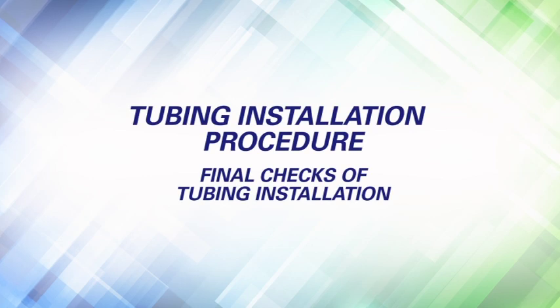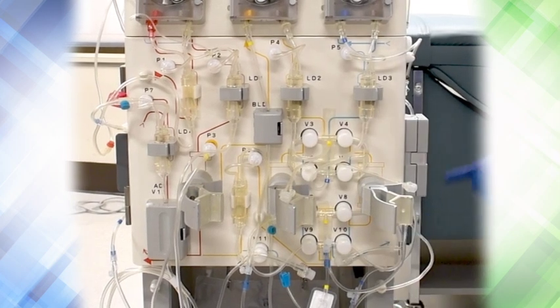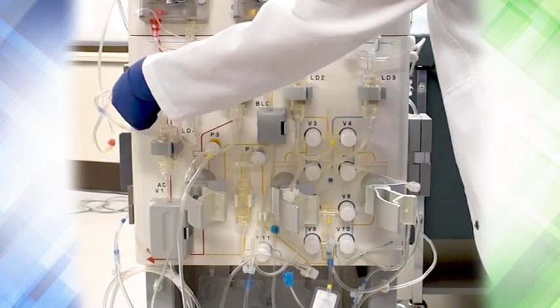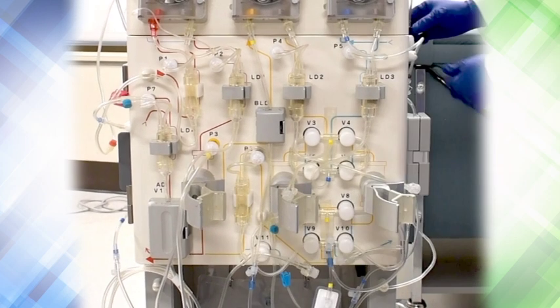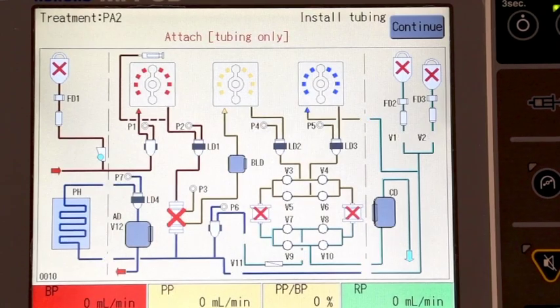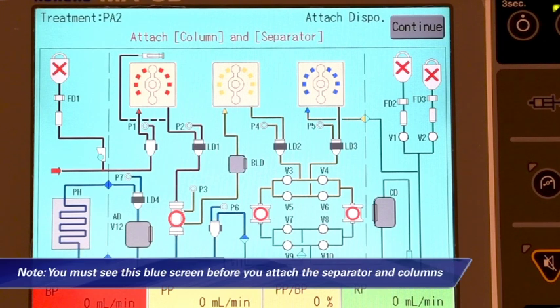Final checks of tubing installation. Ensure all seven tubing connections are tight. All seven pressure filters are connected securely to the pressure ports. All tubings are inserted correctly into the 11 valves. Check that all four pumps — the blood pump, plasma pump, replacement pump, and infusion pump — are all installed correctly. After this final check, press continue to close all the valves. The screen will turn blue and the attach disposable device window will open. Note: you must see this blue screen before you attach the separator and columns.